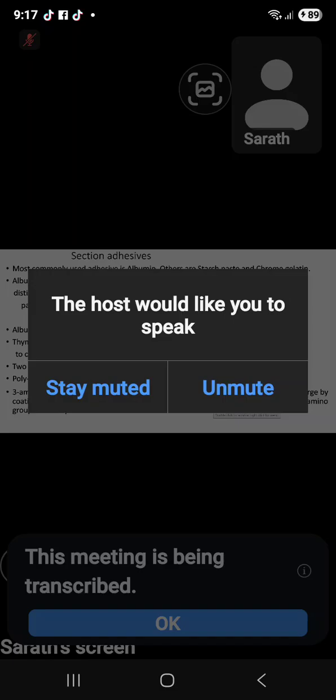But I'm not recommending all these for immunohistochemistry. Only poly-L-lysine or 3-aminopropyltriethoxysilane, APS, or charge slide or plus slide. These two slides are used for immunohistochemistry. Don't take any other type of slide.